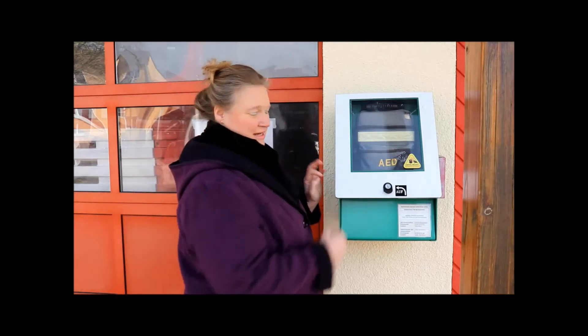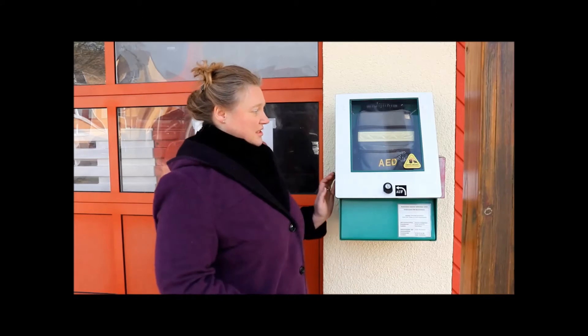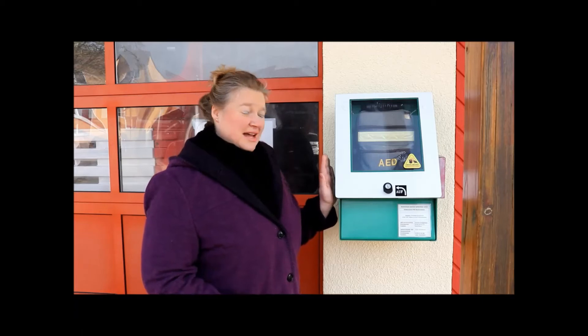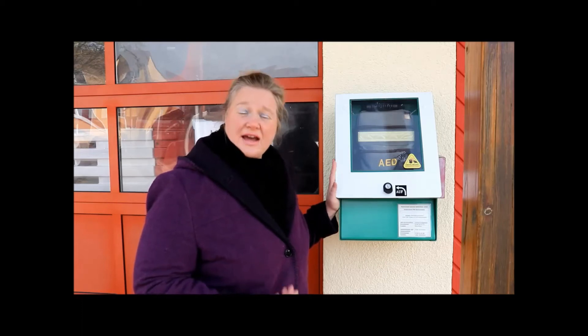Es gibt verschiedene Möglichkeiten, diese Geräte zu entnehmen. Bei uns hier in der Feuerwehr gibt es einen kleinen Schlüssel an der Seite. Den schlägt man ein, öffnet damit das Fach und kann dann das Gerät entnehmen. Es gibt andere Geräte, da drückt man einen roten Knopf, wird mit einer Notrufzentrale verbunden und kann einen Notruf absetzen mit den üblichen Daten.